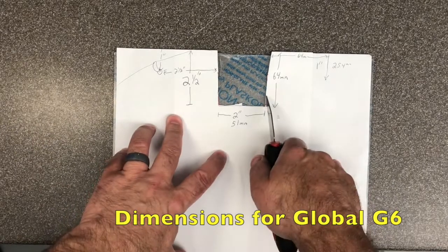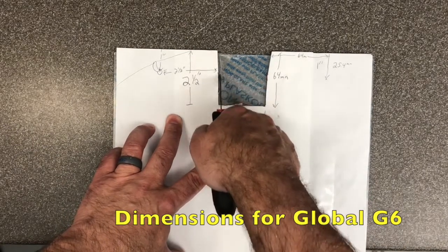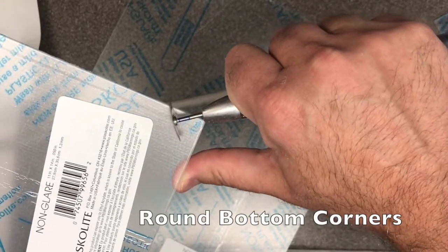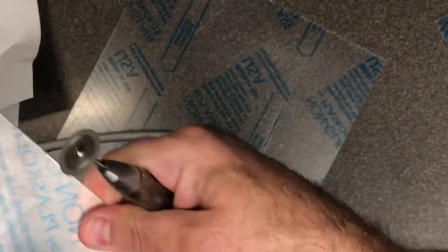These are the dimensions for the older model Global G6 you see in the video here. This plastic material is easily cut with equipment you have in your office. This is 1.3 millimeter or .050 inch thick plastic, easily available at Home Depot or any home store.